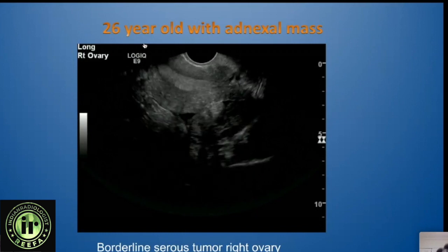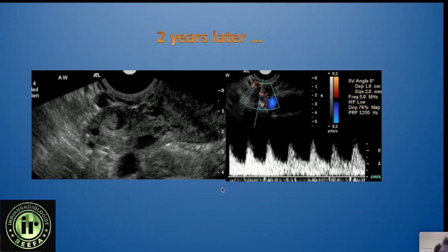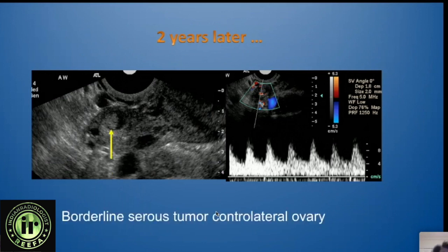She returned two years later and we were now looking at her left ovary. There was a small lesion that didn't quite look like a hemorrhagic follicle — it was a bit too nodular and had flow within the soft tissue. This turned out to be a serous tumor in the contralateral ovary. Fortunately, in the two years between procedures, she was able to have one child.